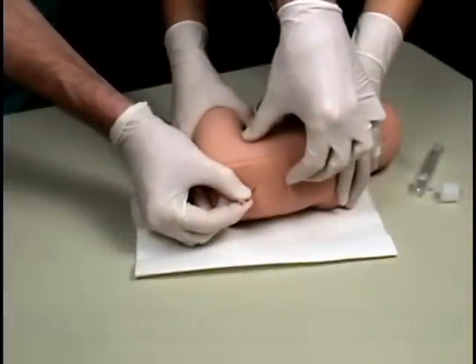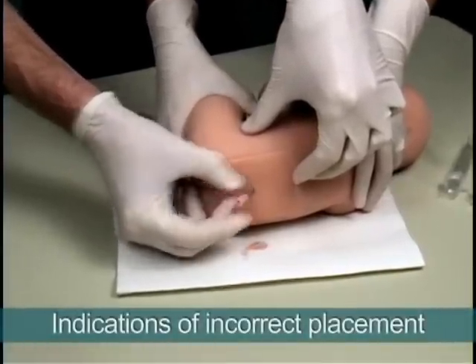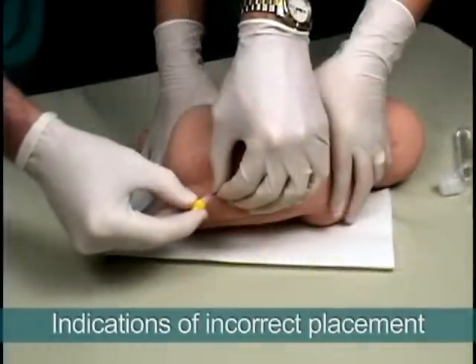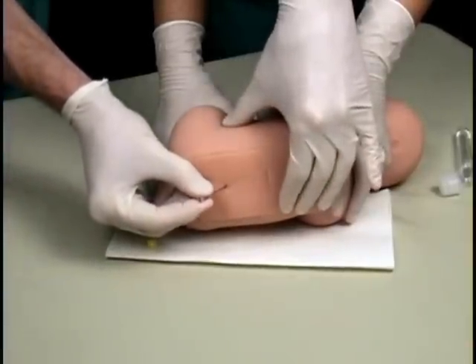The model also includes the epidural venous plexus to provide an indication that the needle has been inserted too far. The bony spinous process also provides the user with feedback for improper needle placement.